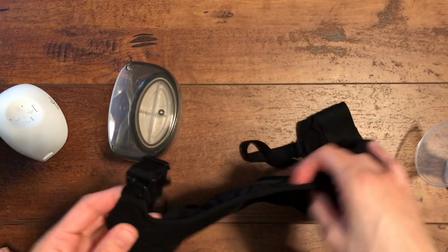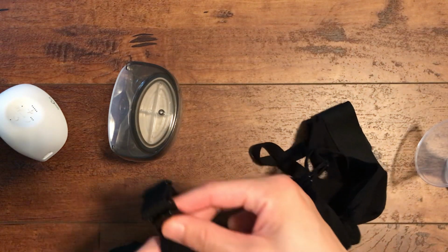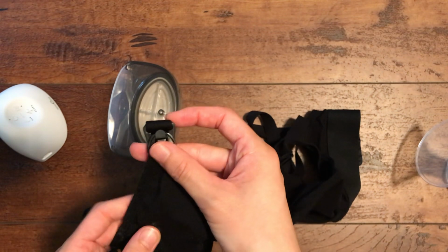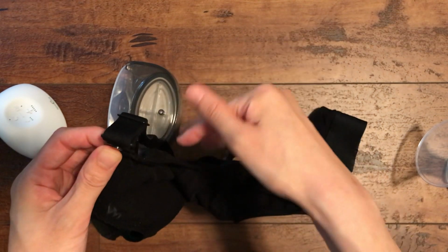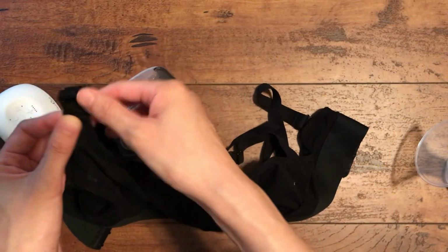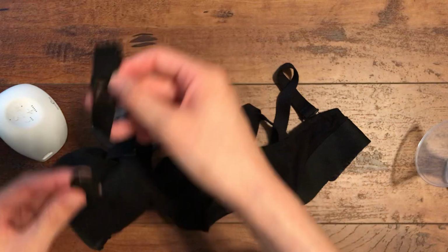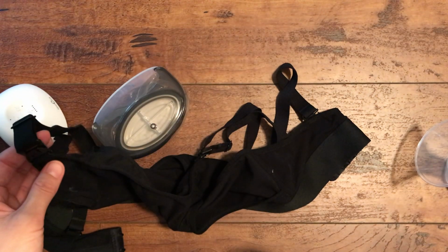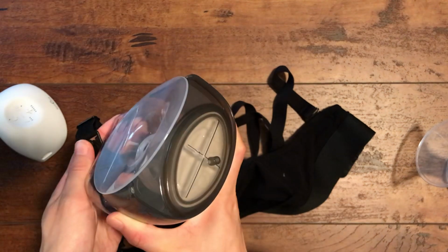So I made a mistake initially of moving around too much, because I was afraid that, oh, I don't want to pump for 20 minutes and not have any output. So I used to check constantly. I placed the unit in the bra, and then I used to constantly open this, unhook this, to make sure it was working. And I think that messed up the suction. So I would try not to do that.